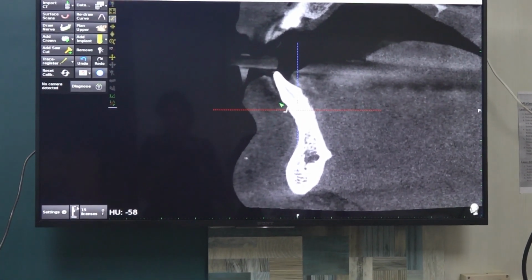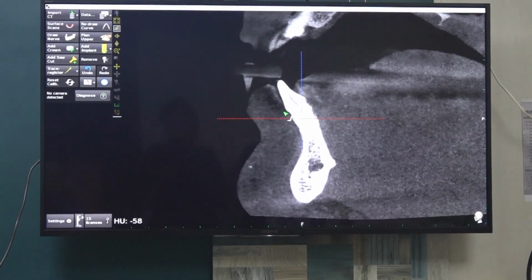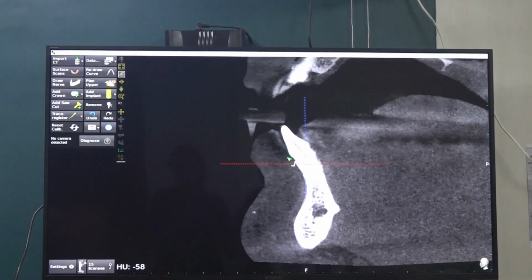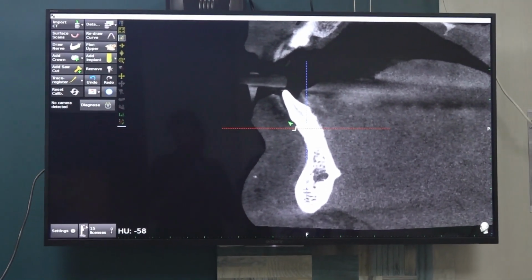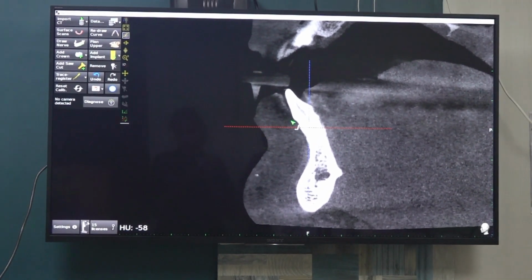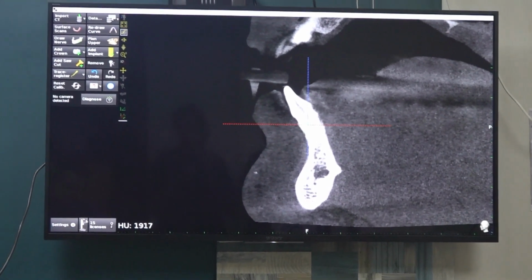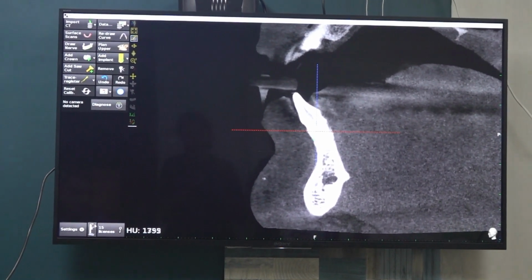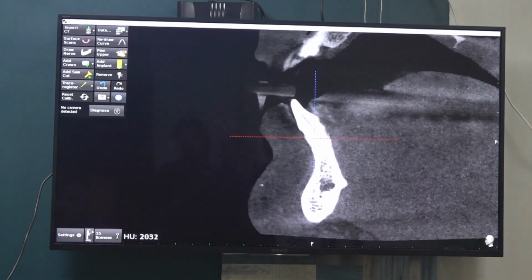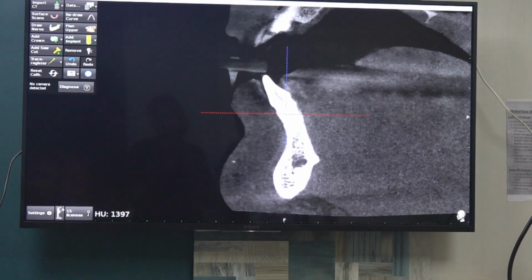Whenever you are planning for extraction and implant placement in the lower anterior without any alveoplasty, it is better to place a basal implant, because labially there may not be bone, right? If you place compressive, it may get exposed. So the first criteria in designing basal or compressive is presence of a labial bone or not. If the labial bone is not good or compromised, very thin, don't place compressive.